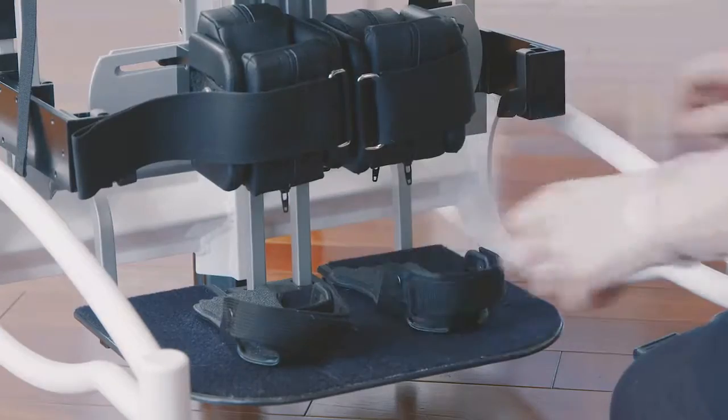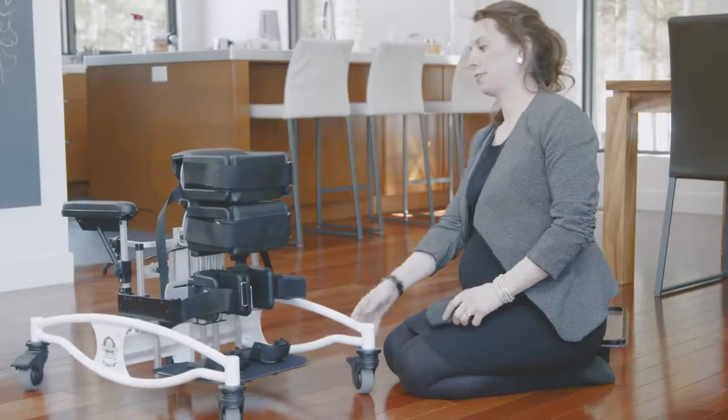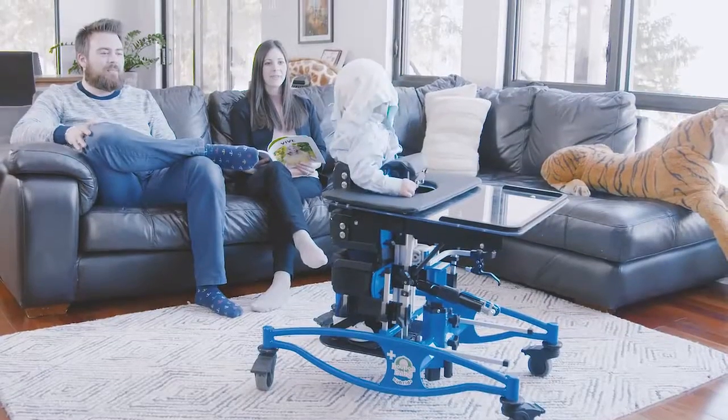These were the few quick and easy adjustments for converting a hybrid from a supine position to a prone position. Let's get started.